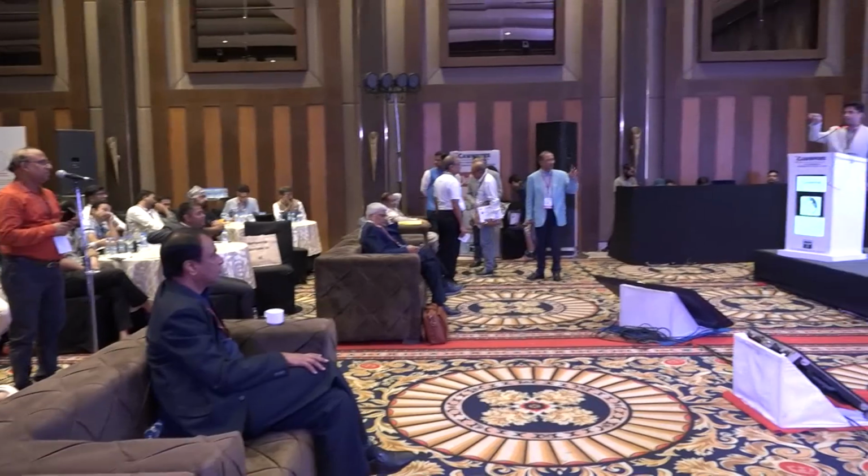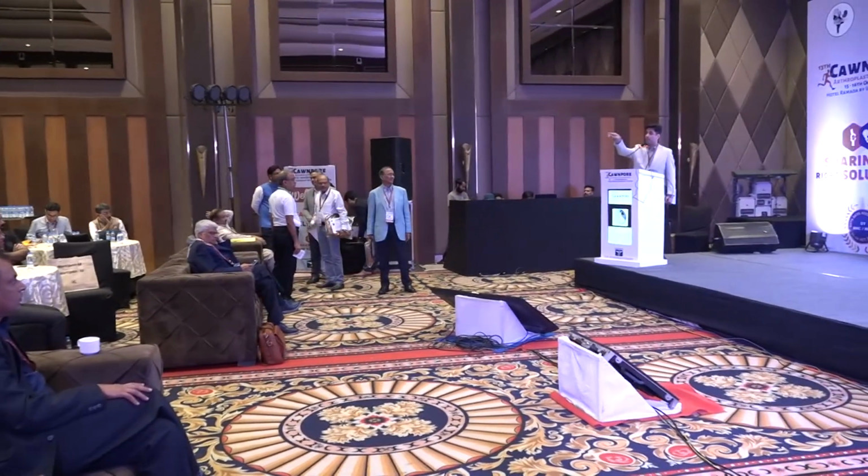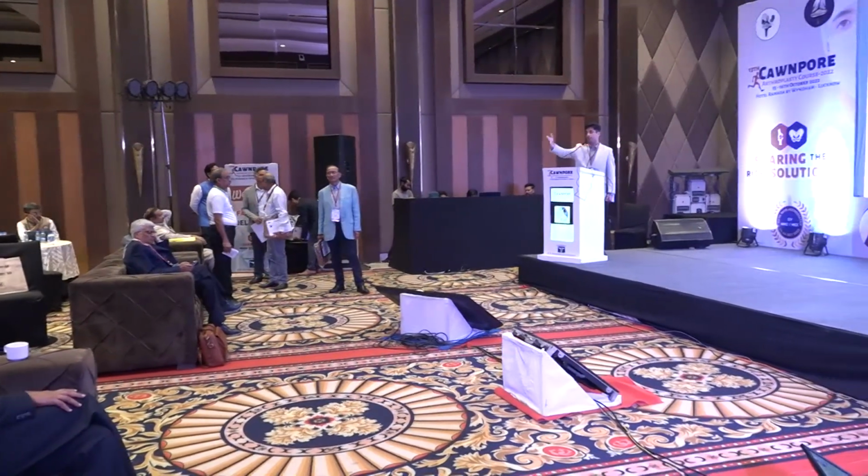If it's a cemented Austin Moore, it will not work. It may work in a Thompson's. See, why sir is saying this is because the cemented Austin Moore has big fenestrations, and the fenestration allows cement to penetrate from the front to the back, so you have a bridge of cement.